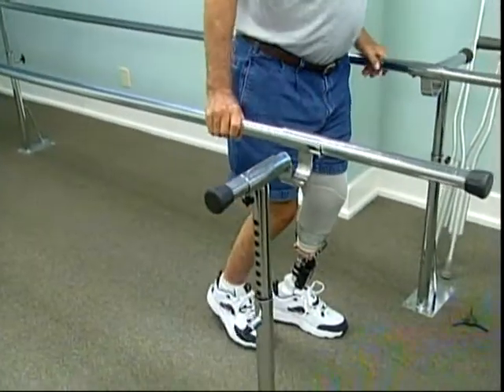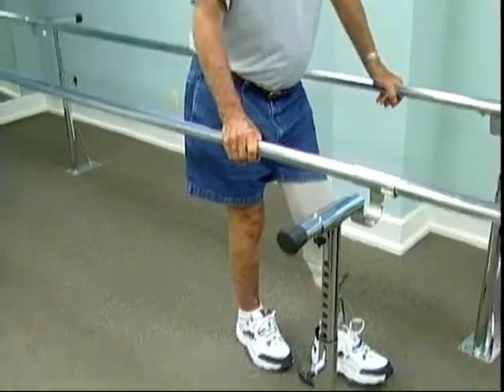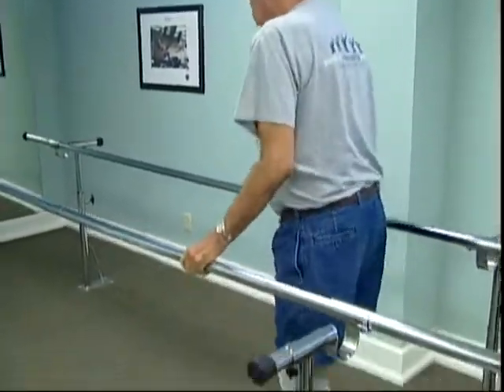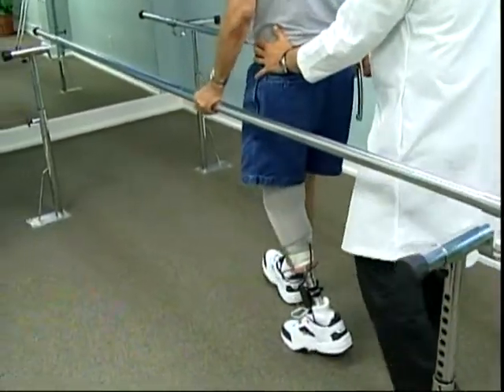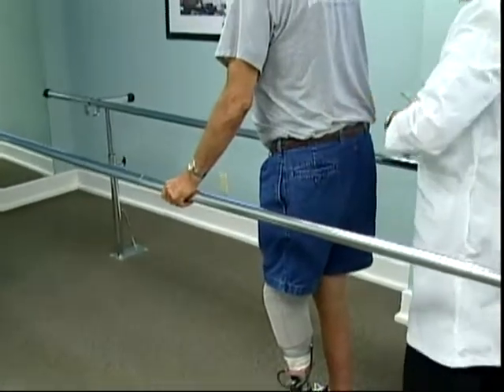So this is the first time he's ever taken steps without any assistance. Yeah, I saw you put your arms down. I can't believe how good it feels. Okay, turn around for me there. I mean, it's like it's part of me now. Now I want you to hold up right there for me. Put your weight even on both legs. That's it.